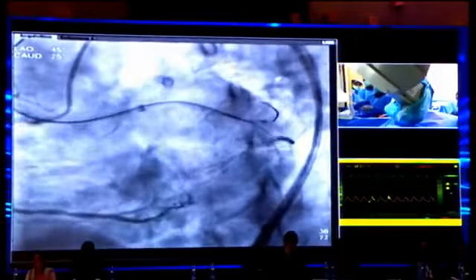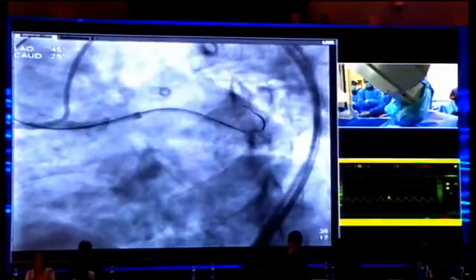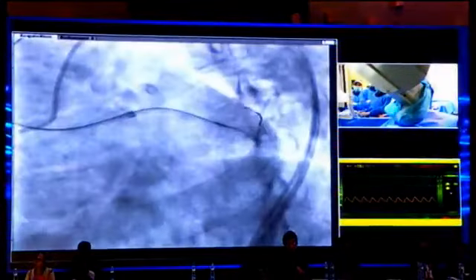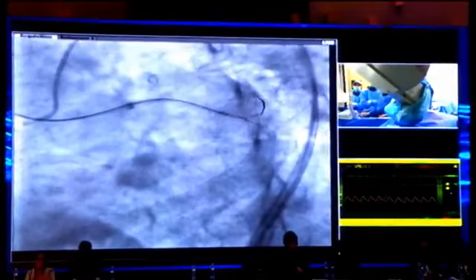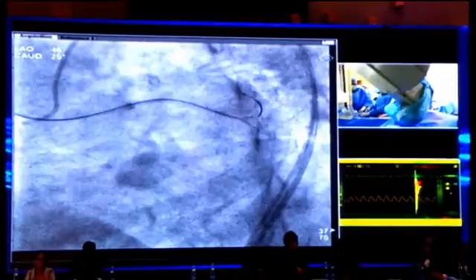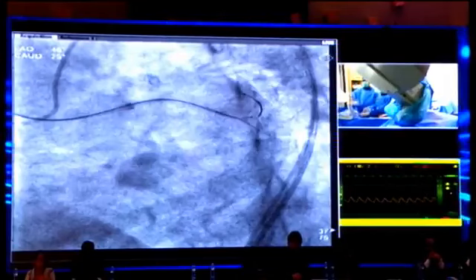Do you agree? Yeah, we agree. If we can go easily antegrade, that's fair enough. But we are only worried that we don't want any subintimal plane or something, because we have 2 large branches coming up. Yes, we don't know about the bifurcation lesion. Yes, please save fluoro. And please repeat this saved fluoro image. Please run, please. And as I mentioned before, I would like to advance downward.